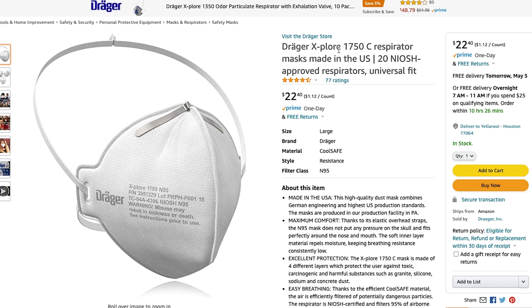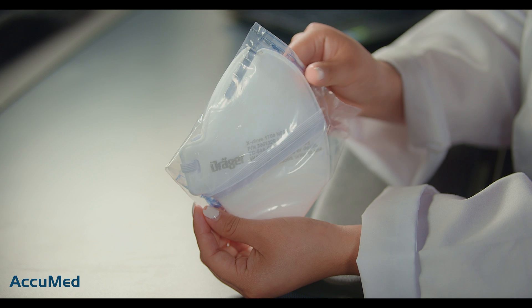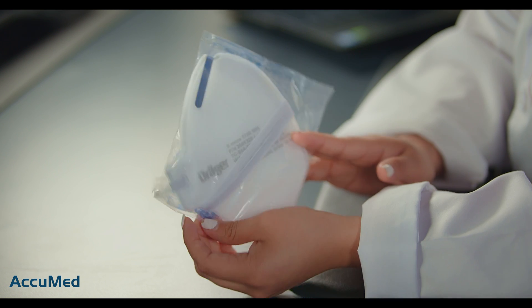Here are the Draeger Explore 1750C respirator. They are made in the U.S., they come in a pack of 20, they have a 4.6 out of 5 rating, and they are being sold by the actual manufacturer. This is how they look out of the box — they are individually wrapped.